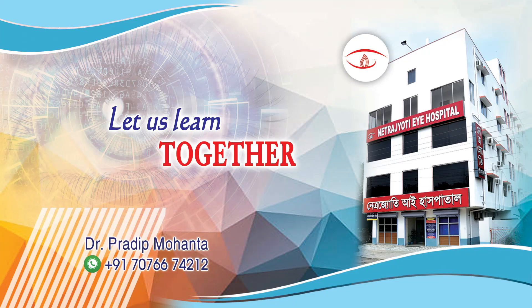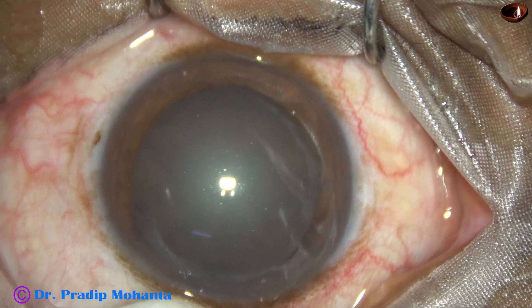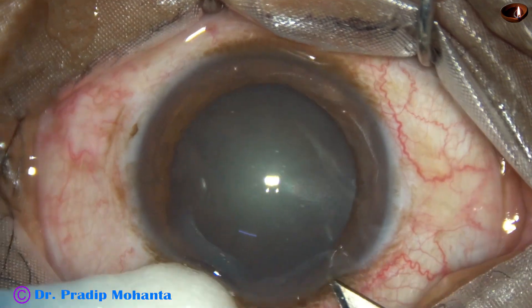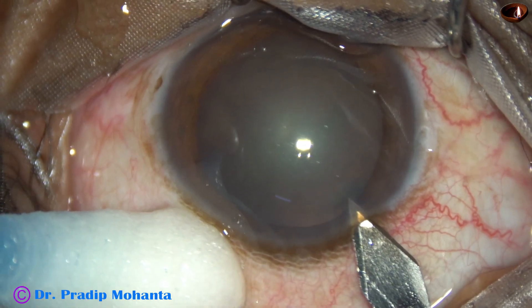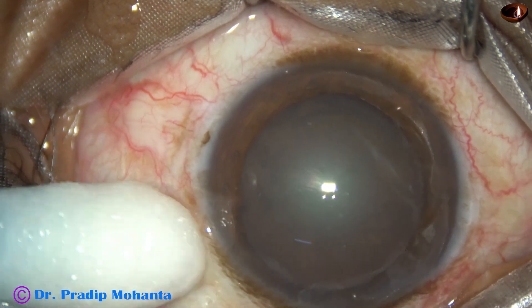Friends, welcome to my workplace at Ranaghat, West Bengal, India. This is a cataract with grade 2 nuclear sclerosis. This is a totally unedited real-time surgery. The patient is under topical anesthesia and has a strong Bell's phenomenon, always looking up towards the forehead.